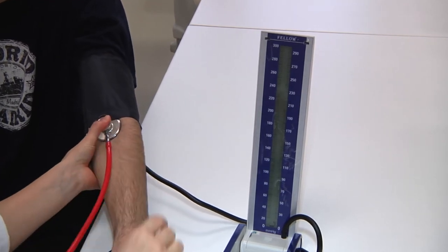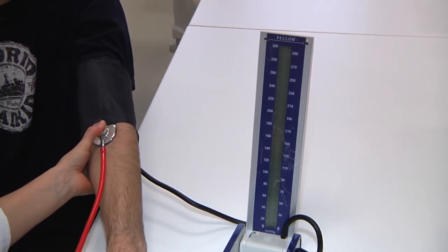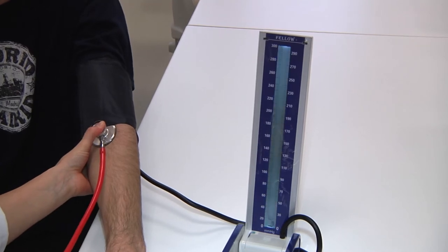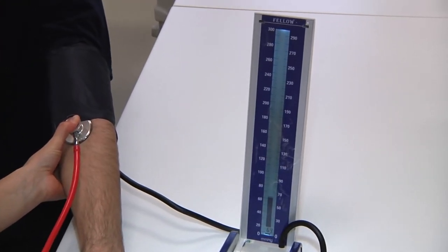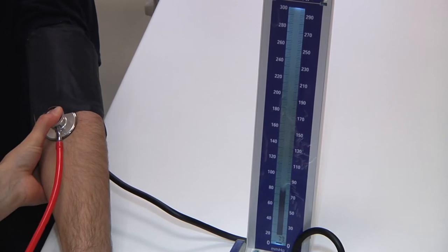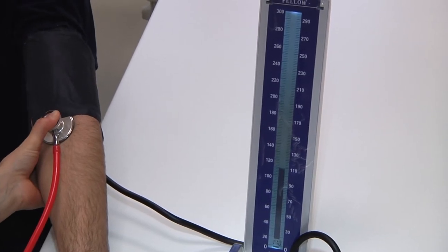We will start with the inflation of the cuff to values that are expected to be higher than systolic blood pressure. In our case, it will be 155 or 160.